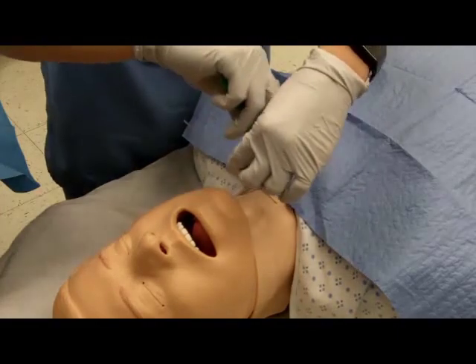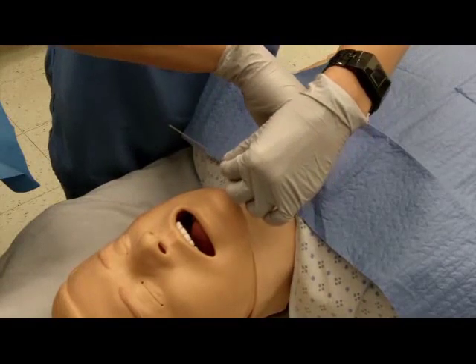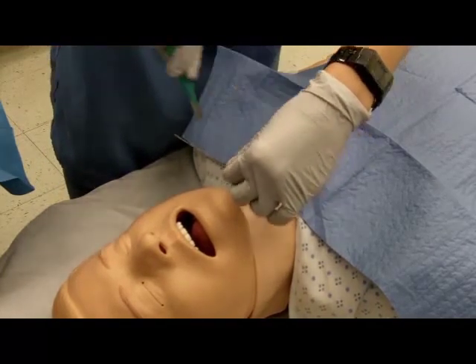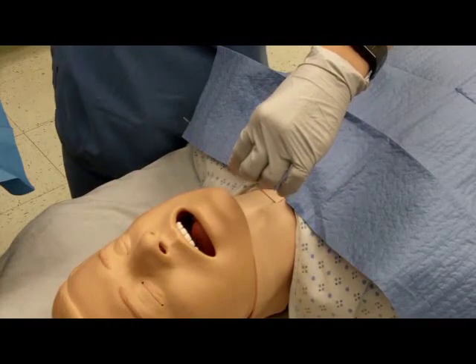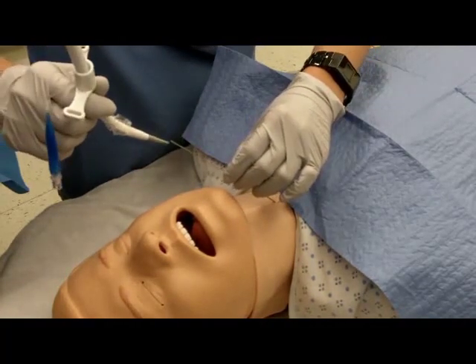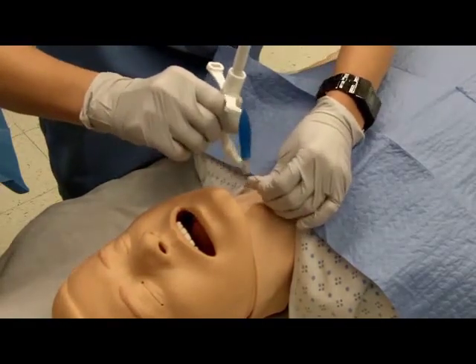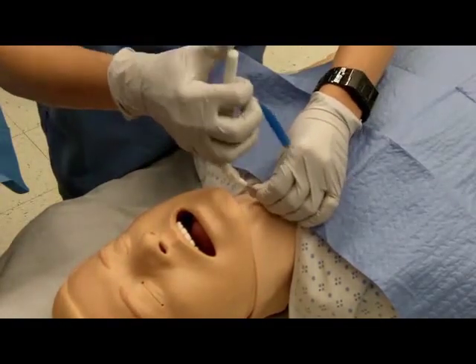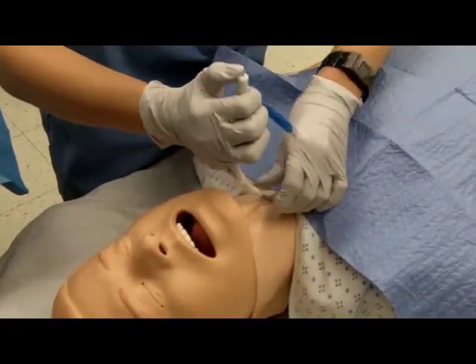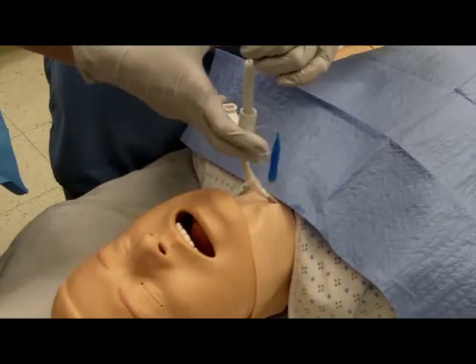Make a 1-2 cm incision at the skin down to the cricothyroid membrane at the entry point of the guide wire. Thread the tissue dilator over the guide wire and advance into the skin incision along the curve of the dilator. A gentle twisting motion may be needed to advance the dilator.